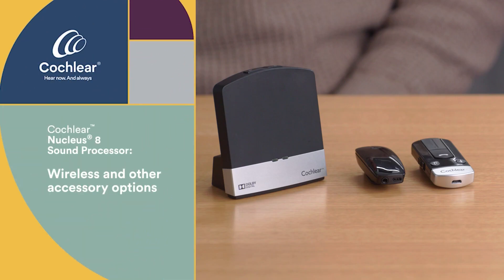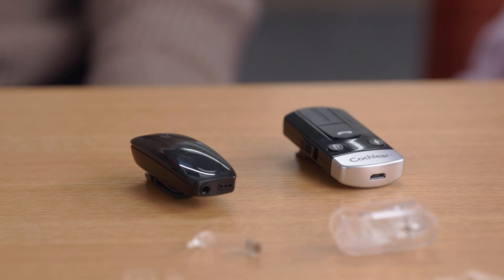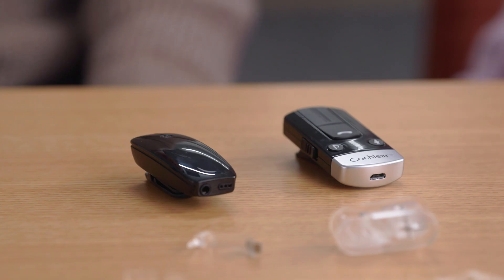Now we'll review the additional wireless and other accessory options available. Your kit may include one or more of these options, depending on the selection by you or your audiologist. While many recipients enjoy streaming from their smartphone with our direct connectivity feature, there may be situations where you want to talk on the phone hands-free. The Cochlear Phone Clip makes it possible to talk hands-free while driving, or hear through other compatible Bluetooth devices. The Cochlear Wireless MiniMic 2 Plus is a helpful tool for situations where you may want to hear someone at a distance, such as a lecture hall, a classroom, or noisy situations like a restaurant. Think of the MiniMic 2 Plus as your extendable ear up to 82 feet.